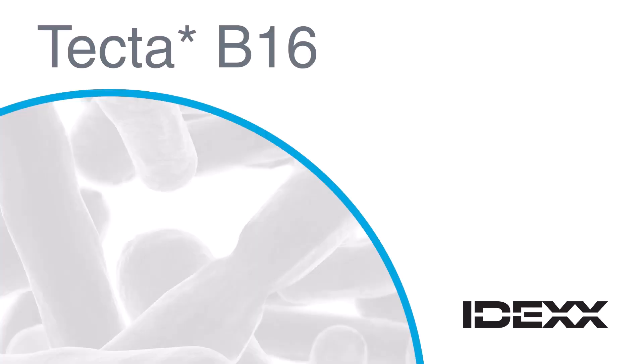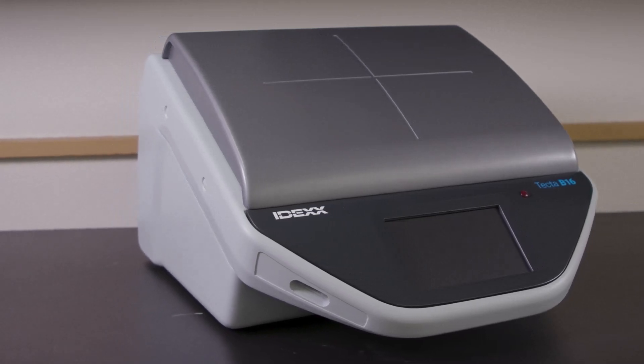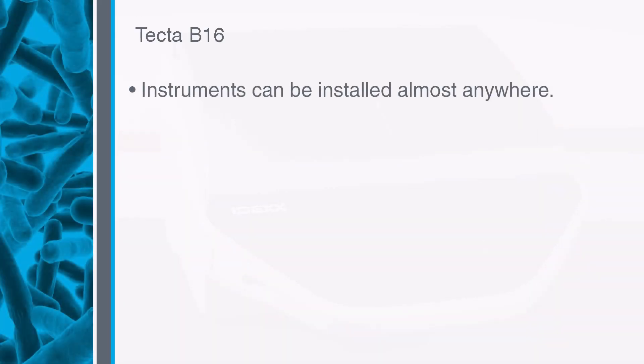The IDEX-TECTA B16 is a rapid, automated microbiology testing system for detecting bacteria in water. TECTA instruments offer several unique benefits and technological advancements in water quality analysis. TECTA instruments are a lab-in-a-box and can be installed almost anywhere, which reduces sample transit times.